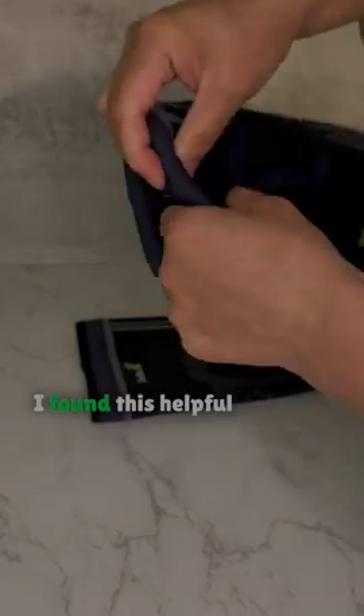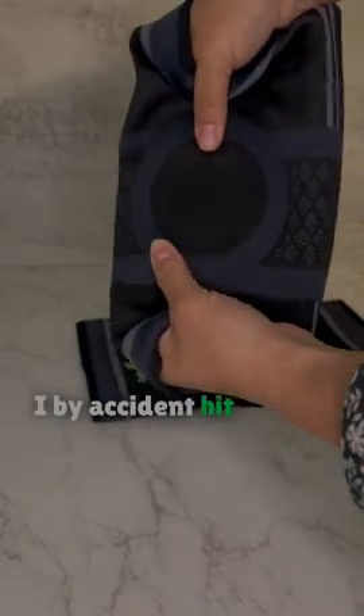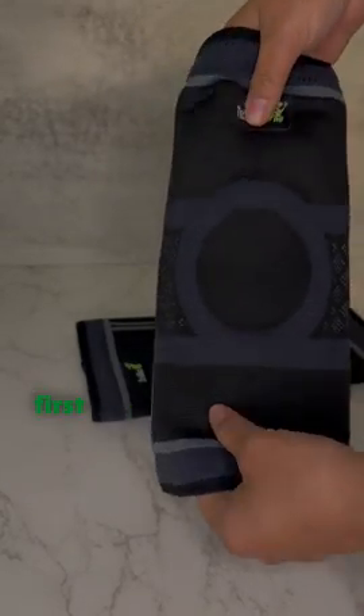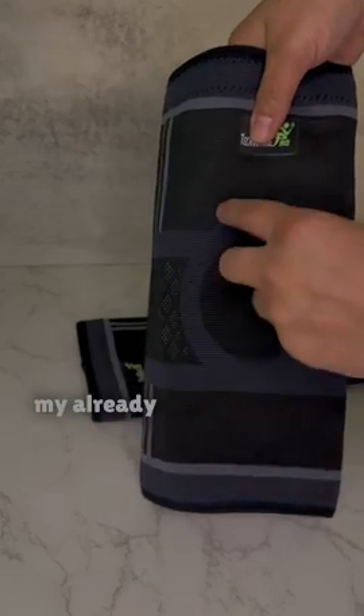which gives some extra support. I found this helpful in situations where I accidentally hit my knee against something, or if I'm bending down to the ground — it hits the gel first, so there was minimal impact on my already aching knee.